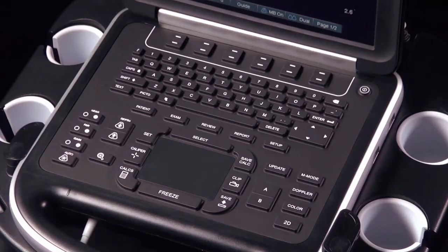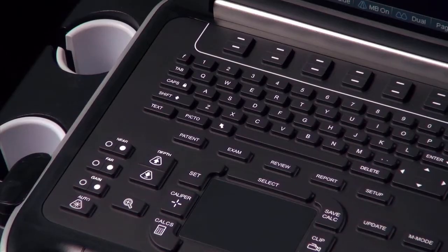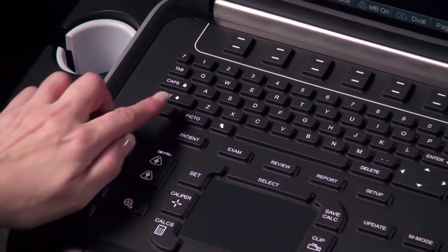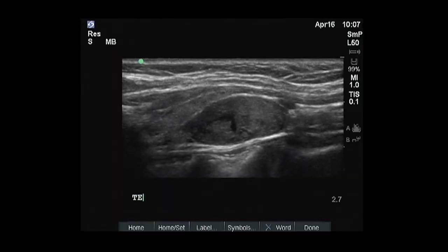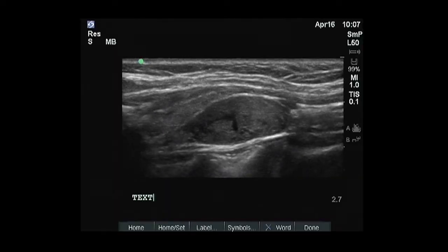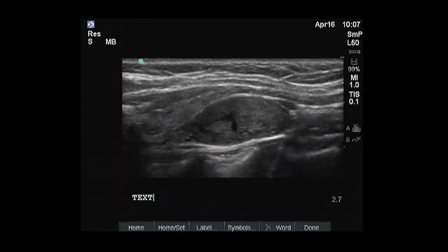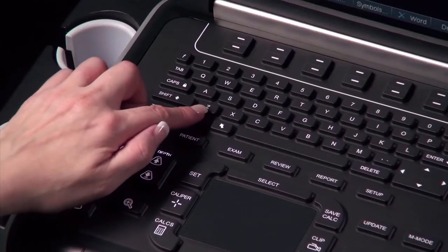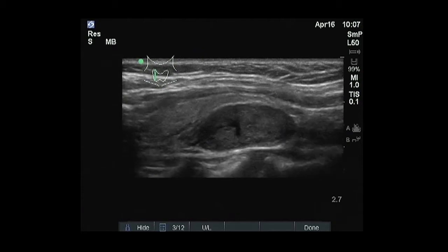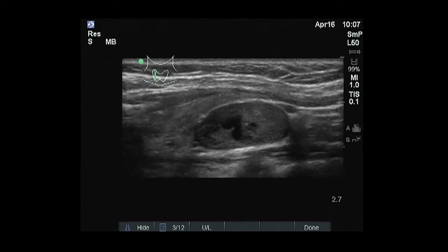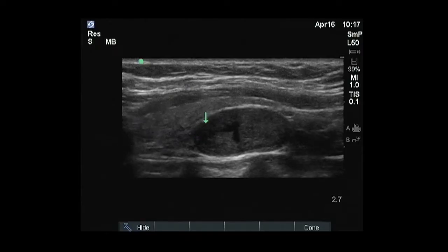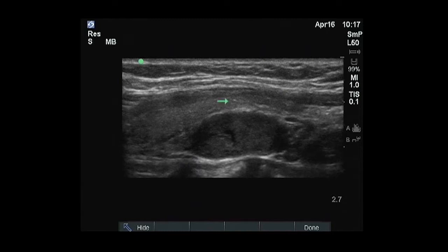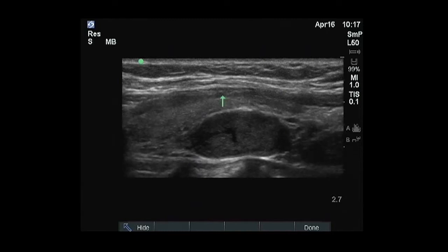The alphanumeric keys are used to enter text and numbers. Text turns the keyboard on and off for text entry. Picto turns the pictographs marker on and off. Arrow displays an arrow that can be moved and rotated within the image area.